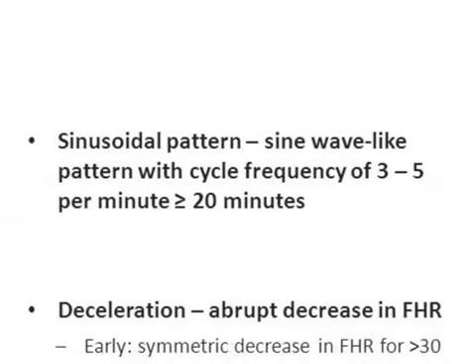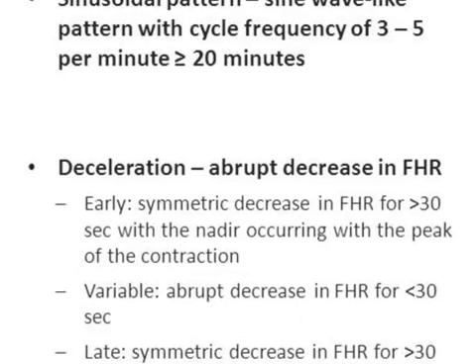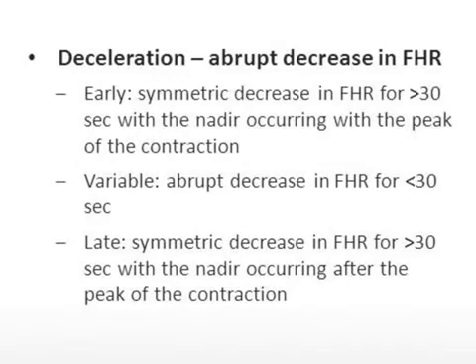Sinusoidal patterns are a sine wave-like pattern with a frequency cycle of 3 to 5 per minute for greater than 20 minutes and can be a sign of fetal compromise. A deceleration is an abrupt decrease in fetal heart rate. A prolonged deceleration is a decrease by 15 beats per minute that lasts for longer than 2 minutes but less than 10 minutes. If the change in heart rate is greater than 10 minutes, then it is a fetal heart rate baseline change.